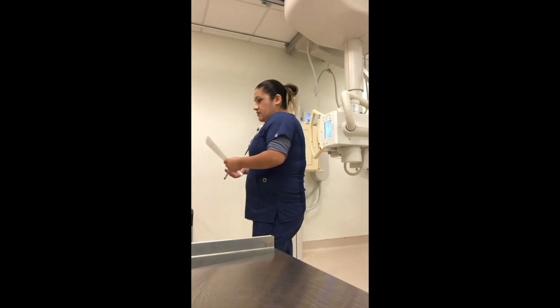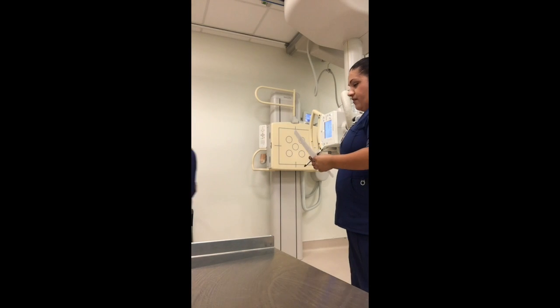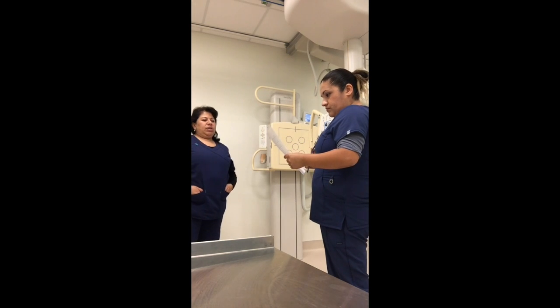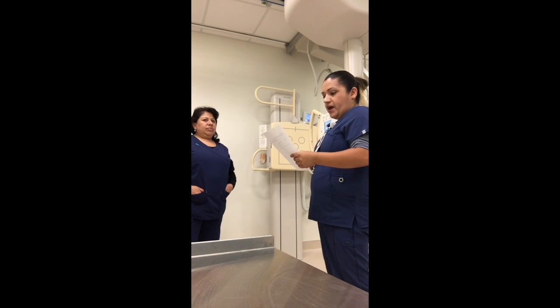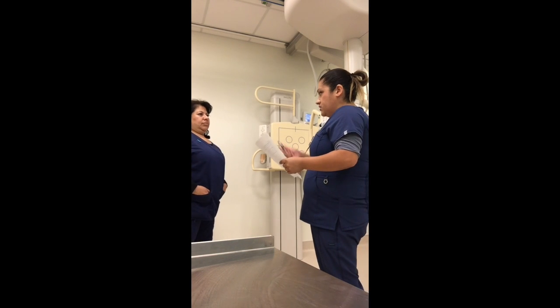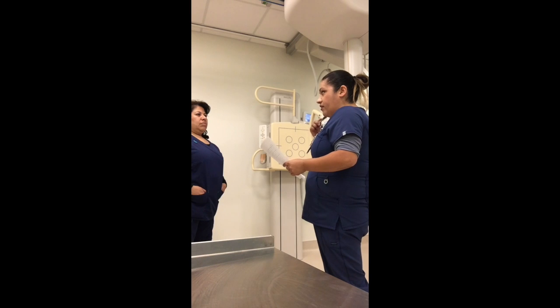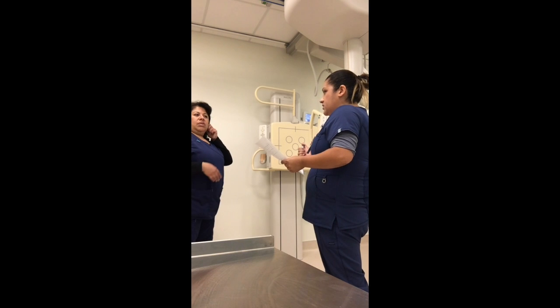Miss Rodriguez? Hello. Can I have your full name and date of birth, please? I'm Erica Rodriguez, February 2nd, 1970. Okay. And is there any possibility of pregnancy? No. Okay. And I see you have earrings. I'm going to need you to remove those. And if you have any hair clips or dentures, I'm going to need you to remove those before the exam.